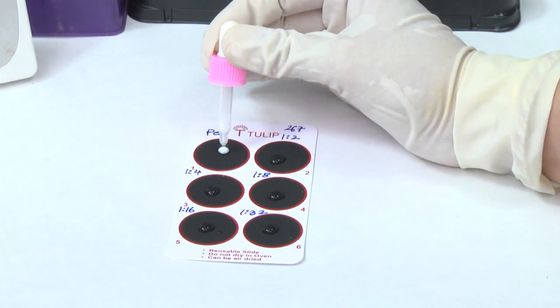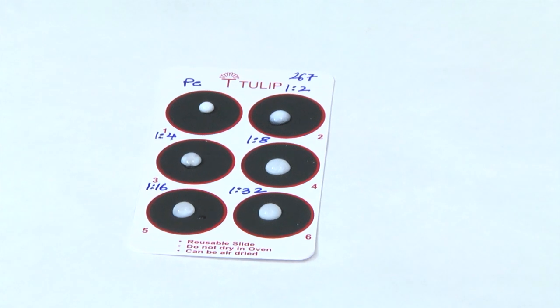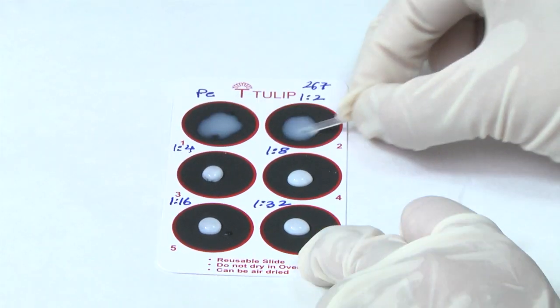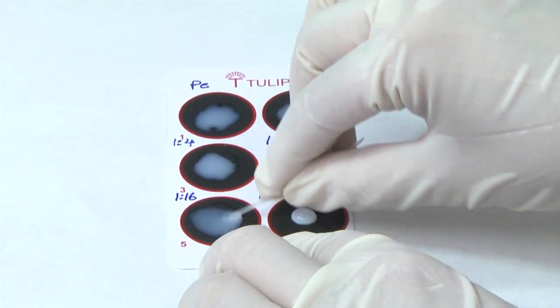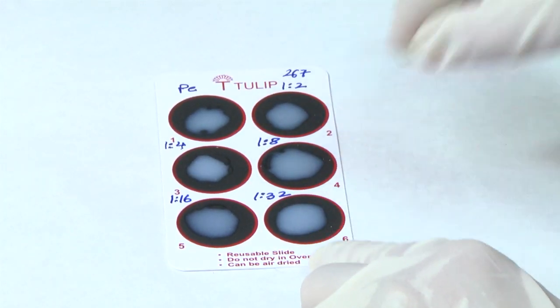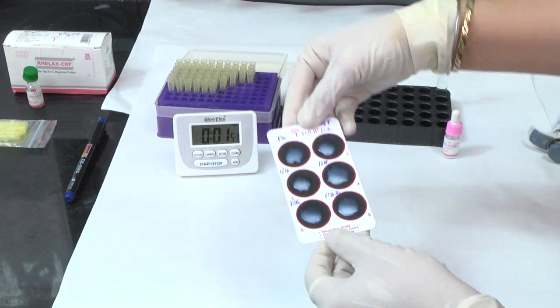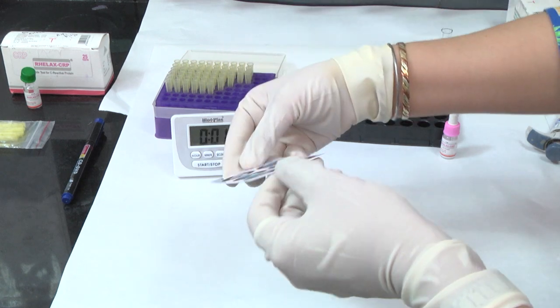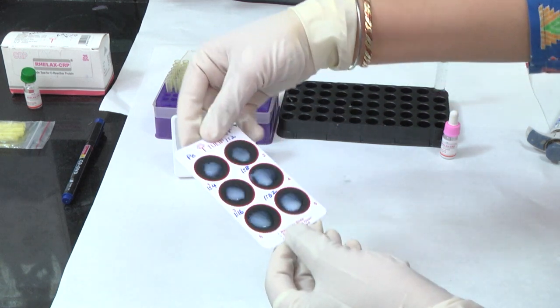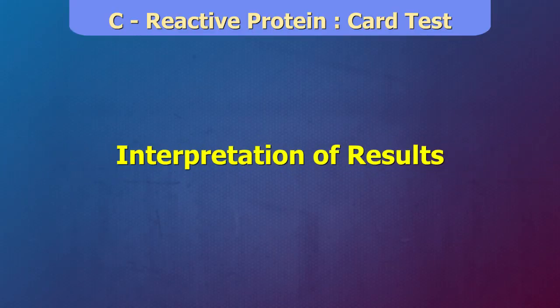Add 1 drop of CRP latex reagent to all the reaction circles. Using a mixing stick, mix the test specimen and the latex reagent uniformly over the entire circle. Immediately start a stopwatch. Rock the slide gently back and forth, observing for agglutination macroscopically at 2 minutes. Interpretation of results.